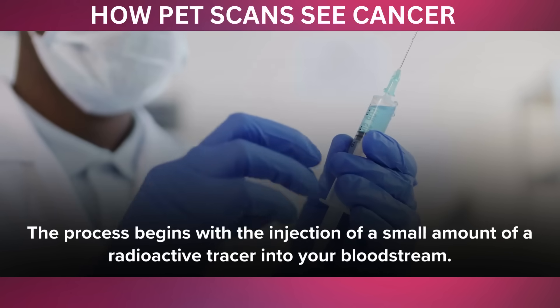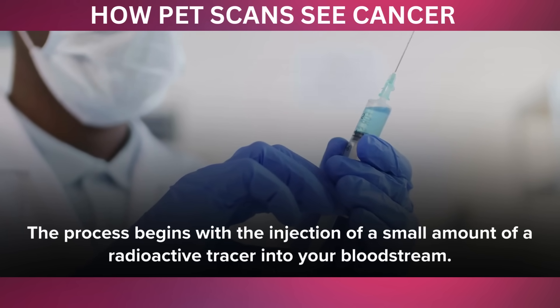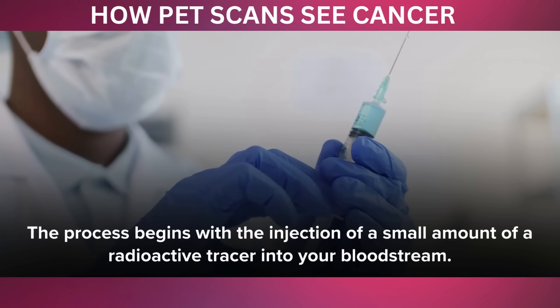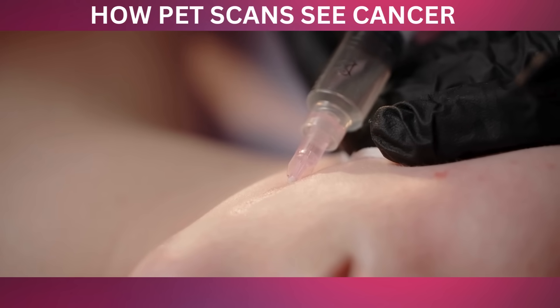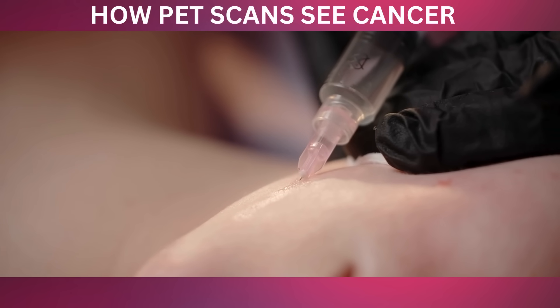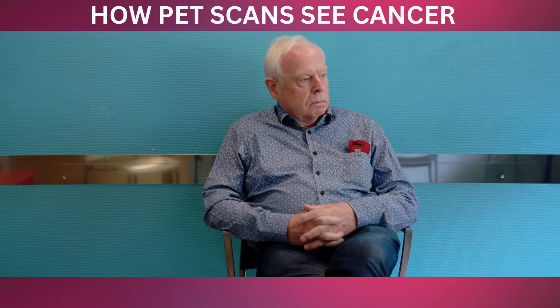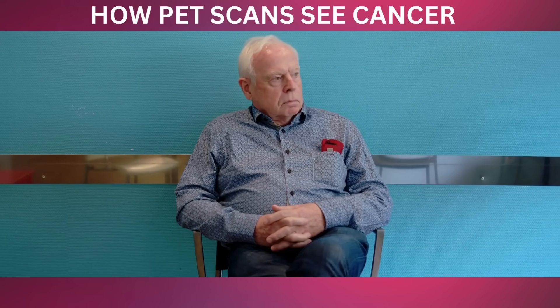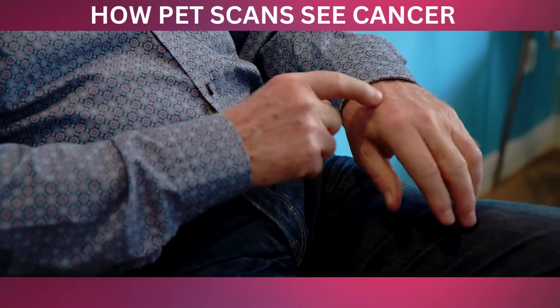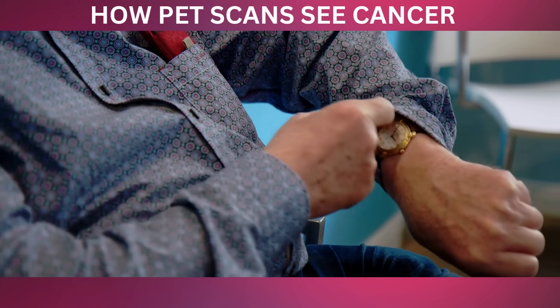The process begins with the injection of a small amount of a radioactive tracer into your bloodstream. The injection might feel like a small prick, similar to a routine blood test. After the injection, you'll need to wait about 30 to 60 minutes to allow the tracer to circulate and be absorbed by your tissues. During this time, you'll be asked to sit quietly and avoid any strenuous activity to ensure the tracer is distributed evenly. You might feel a bit anxious or restless during this waiting period, but it's usually a good time to relax and stay calm.